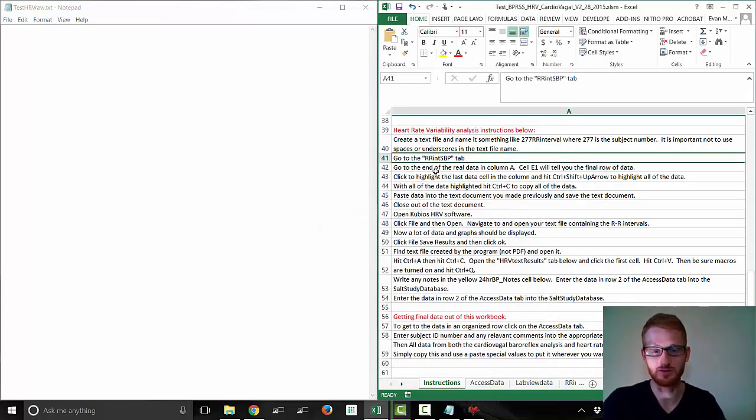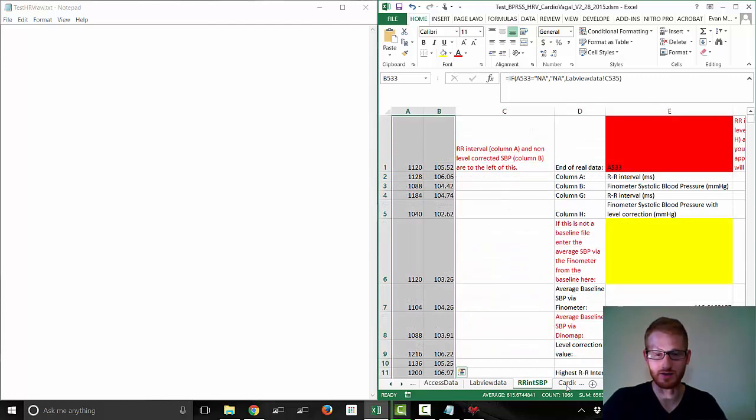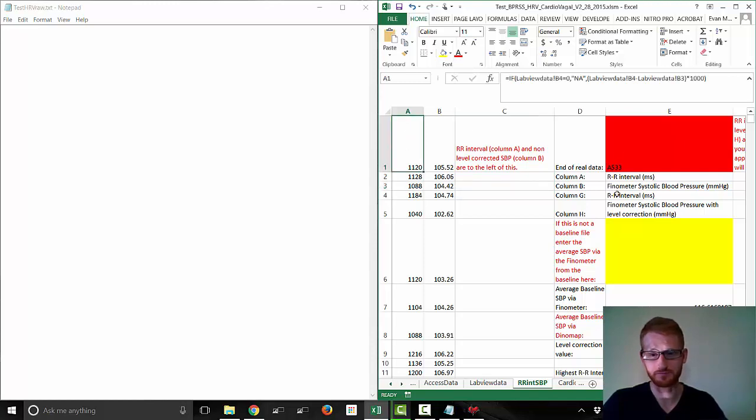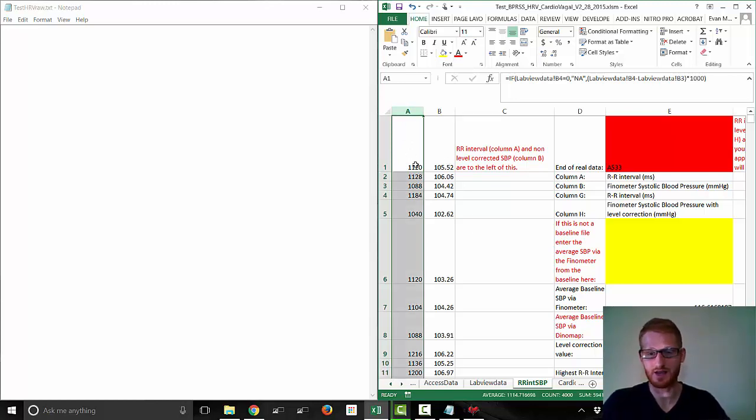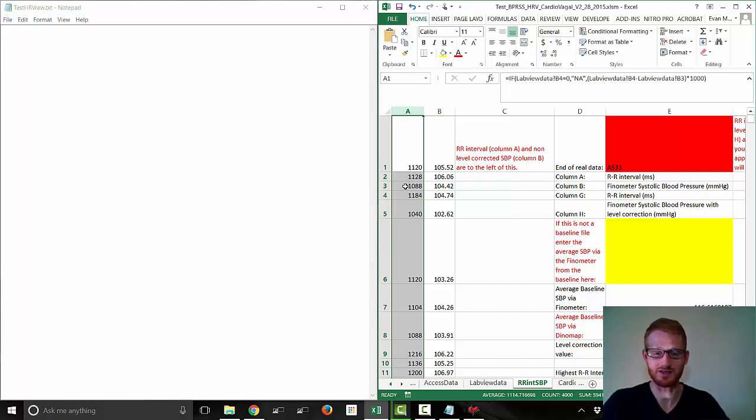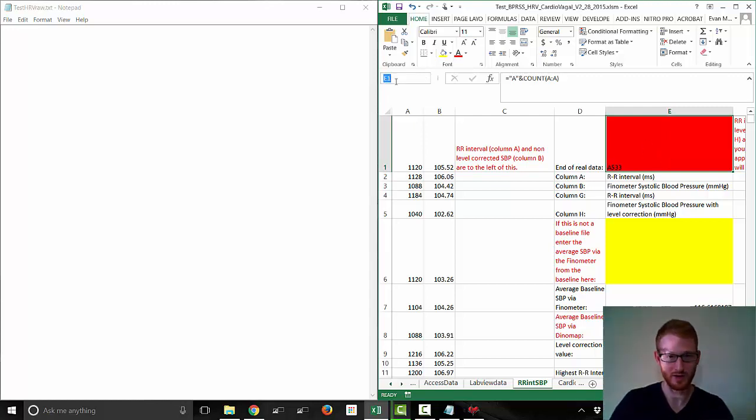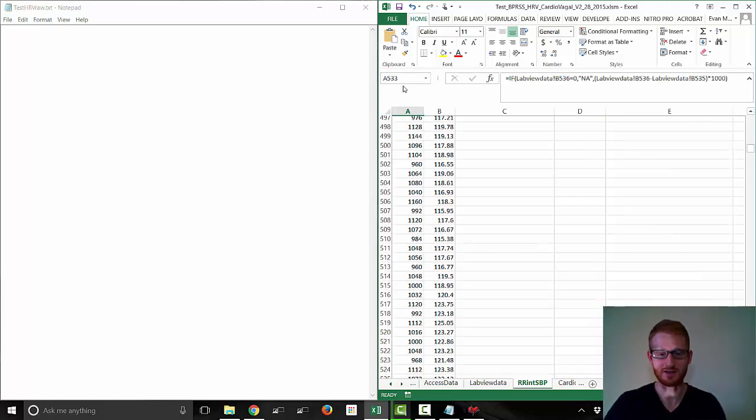So go to this tab here, and we're going to be pulling this data out of column A. Remember from the last video, column A is our RR interval data in milliseconds. We need to find the bottom of this data, and the best way to do that is to look at this cell that tells you the last cell with real data in it. A533, so let's put that here, in this box right here, and just hit enter.